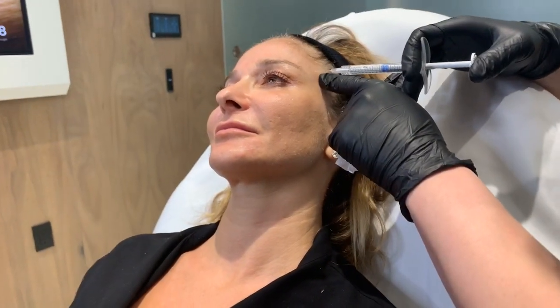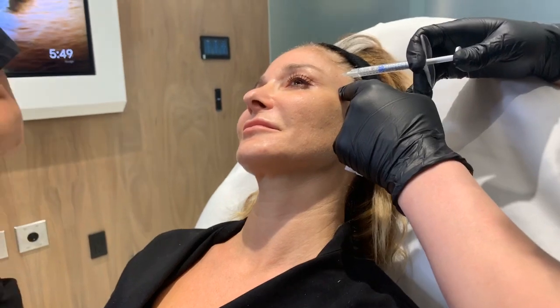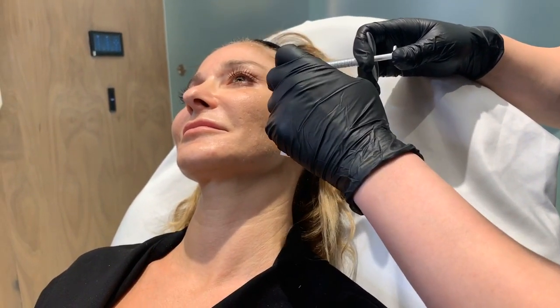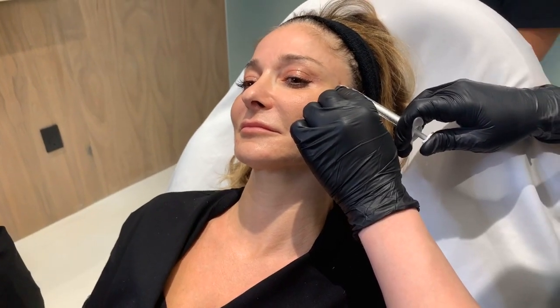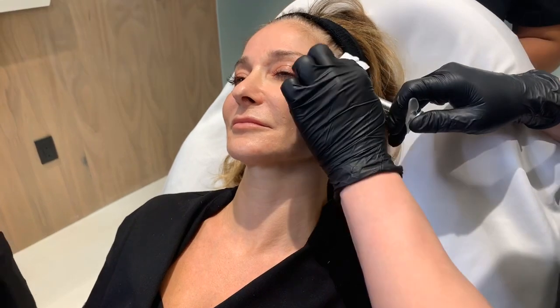Let's start in the temple. And we're going to use Radiesse down deep. Now, when you're a little thinner, the needle might not go all the way. So we're just going to do a subtle bit. She doesn't need a lot, actually. So we're going to do a little in the superficial area up high. And then we're going to come out. We're going to go down a little bit lower, go all the way to the deep area. It feels weird. It feels like someone's crunching on the bone, but that's because we're in a really safe area with almost no bleeding. Take a look.